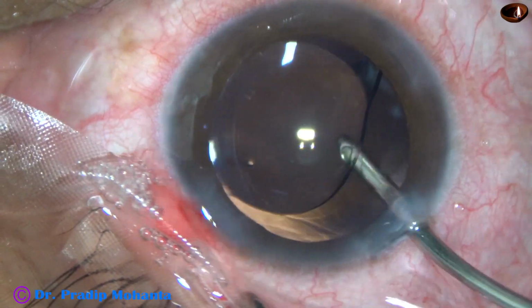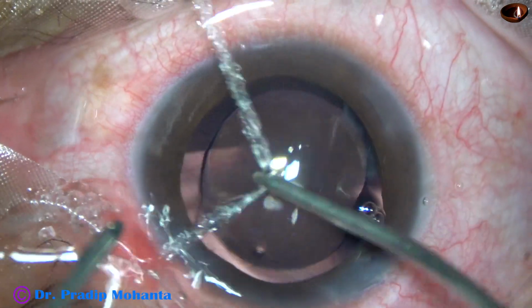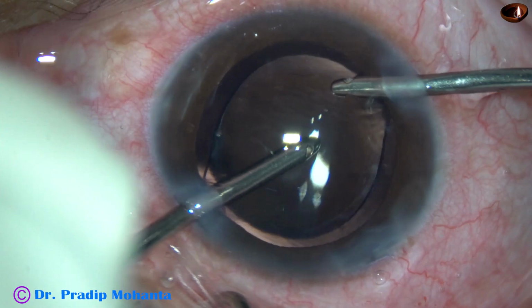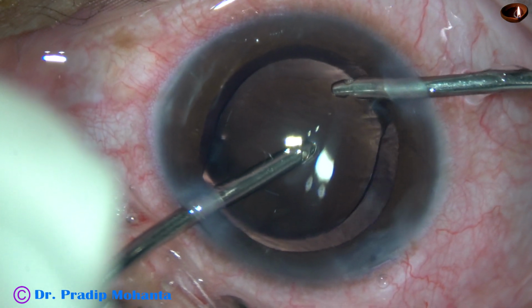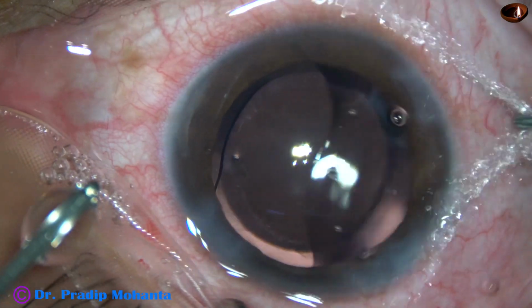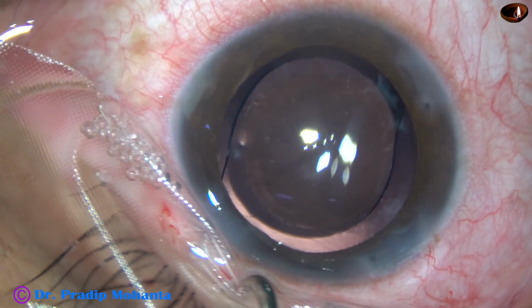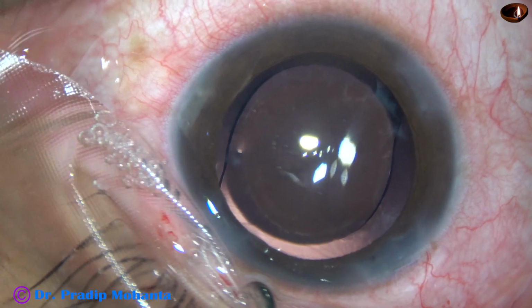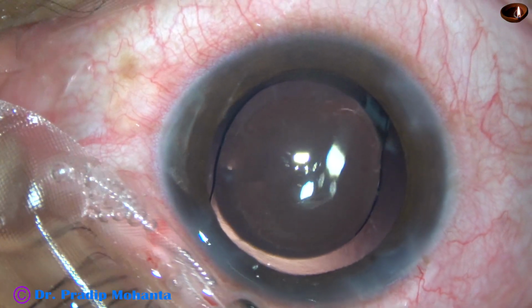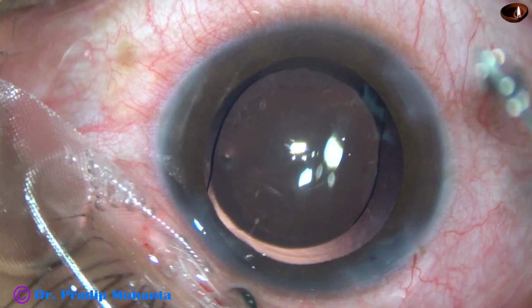This is the irrigating probe. It is being used to irrigate the capsular bag as well as the anterior chamber. And now irrigation and aspiration is being used together. So I have dedicated about 2.5 to 3 minutes for removal of visco. So we must be meticulous in our surgeries.